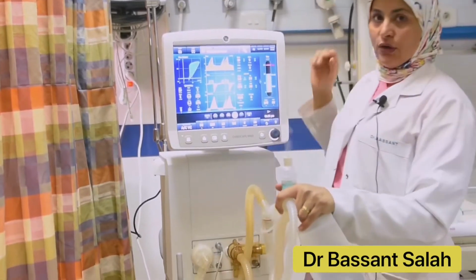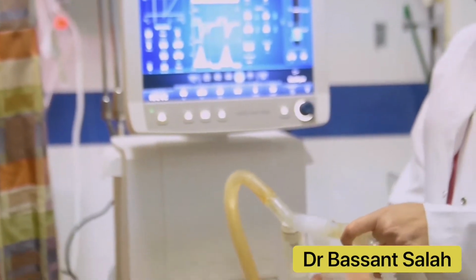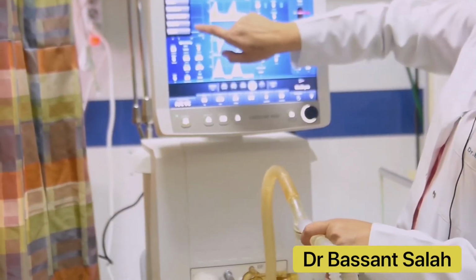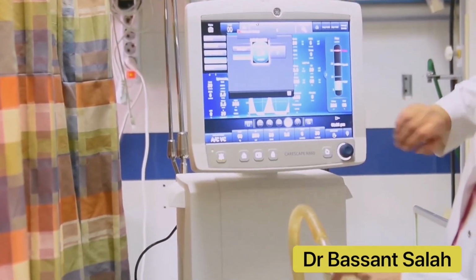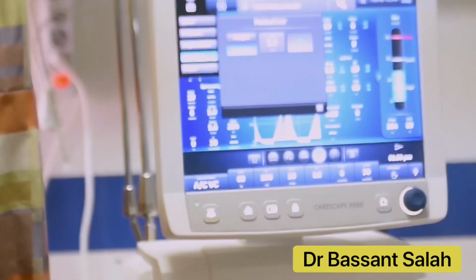I adjust the flow from the wall output from 6 to 9 liters, and I adjust it through the ventilator. I choose nebulizer, pneumatic, and I decrease the bias flow as low as I can. I choose 1, and then start the nebulization.